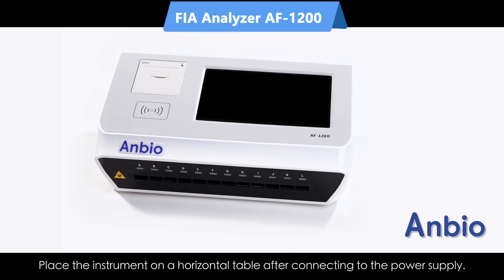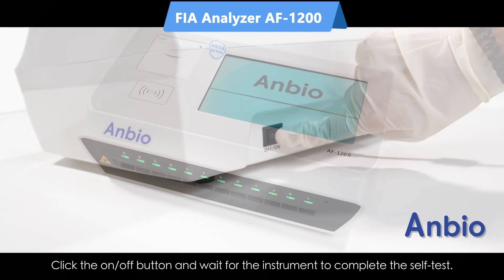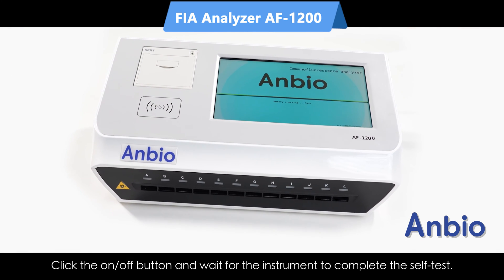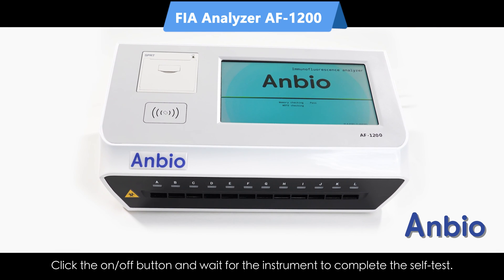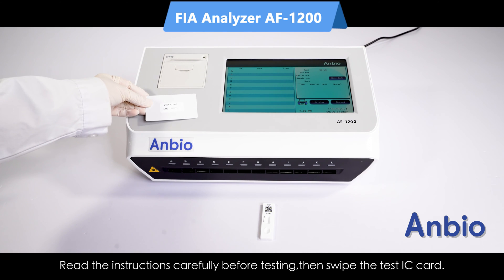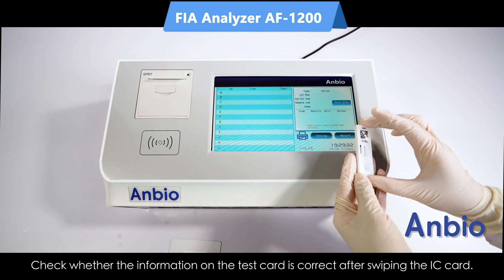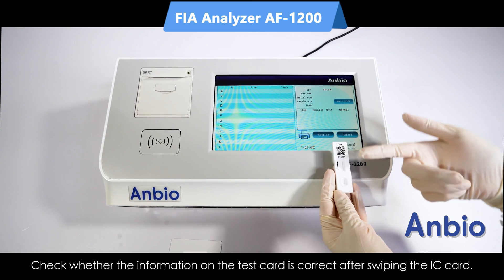Place the instrument on a horizontal table after connecting to the power supply. Click the on and off button and wait for the instrument to complete the self-test. Swipe the test IC card and read the instructions carefully before testing. Check whether the information on the test card is correct after swiping the IC card.